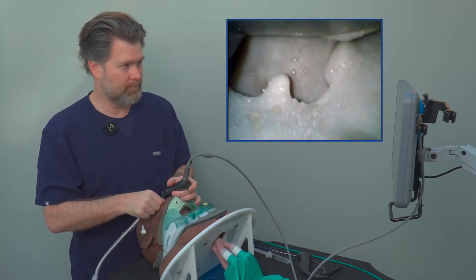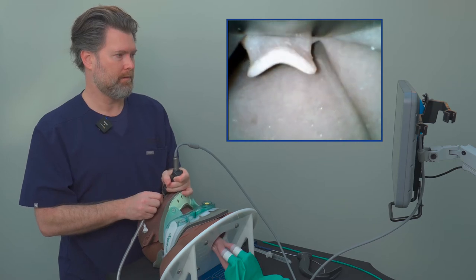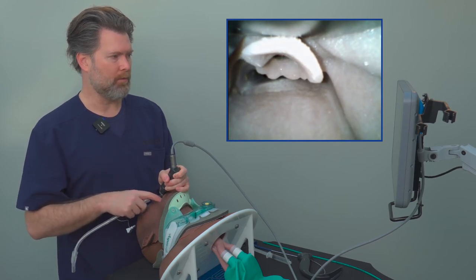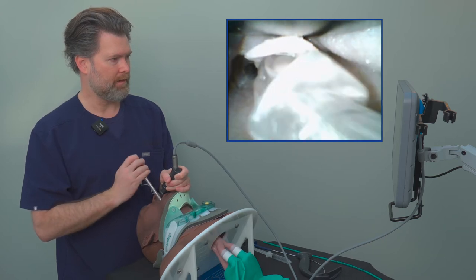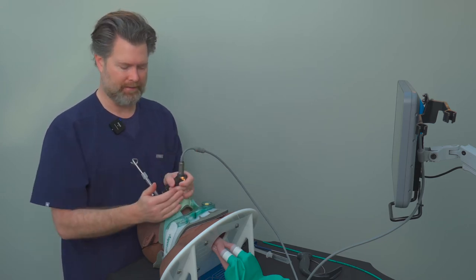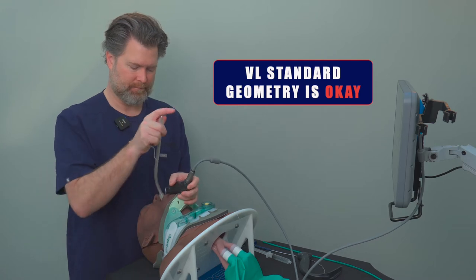Traveling midline around the base of the tongue, I see the epiglottis come into view. I have a pretty decent view but I'm definitely having to apply a fair amount of upward force to get a good enough view — a little more than I think I would with a hyperangulated blade. Going ahead and inserting the tube, that was actually fairly easy. A standard geometry blade with a cervical collar and video laryngoscope works, but it does require more upward force, putting more stress on the neck than ideal.